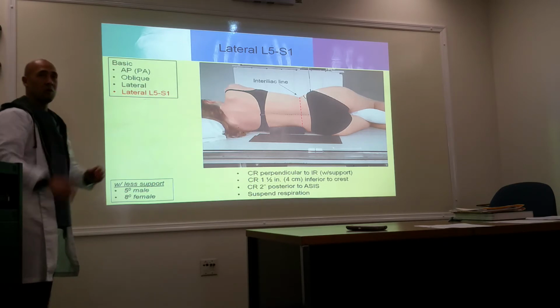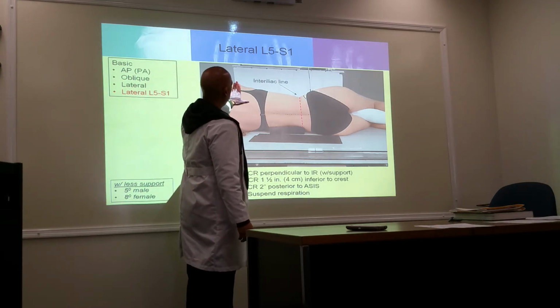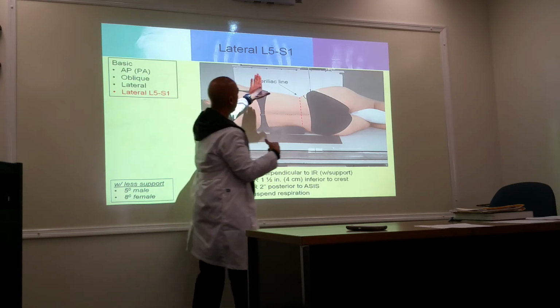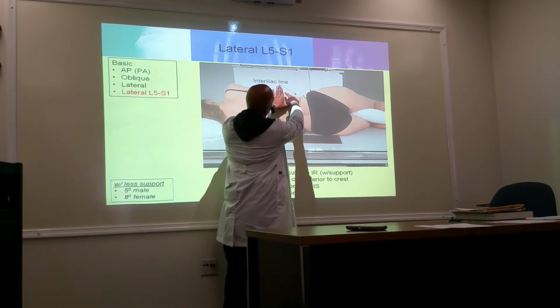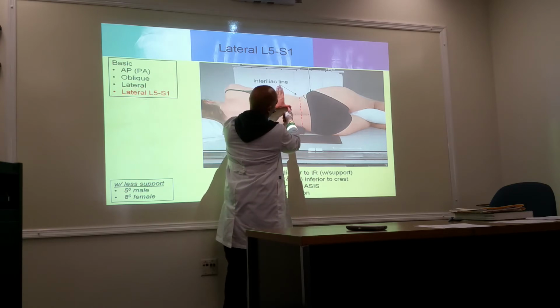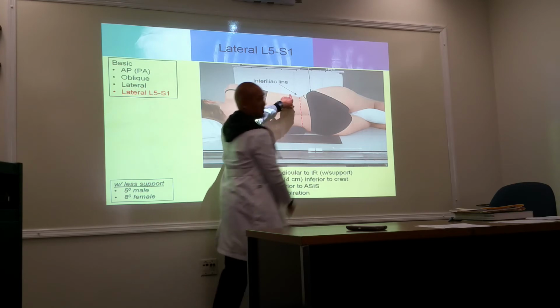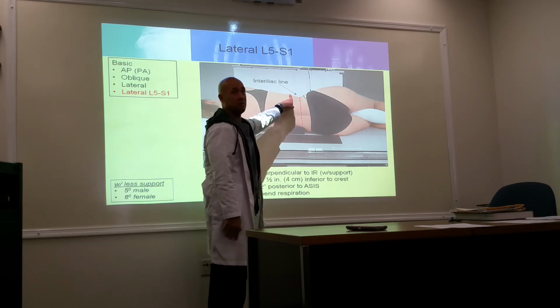Okay. And this is where we were talking about this. What I used to do is put this right on the crest. This is the way we did it. We put it right on the crest. So the imaginary line between here and my thumb joint, where it bisects, is where my central ray is going to be. Is that how you did it? Yours a little bit different? Okay. Yeah.